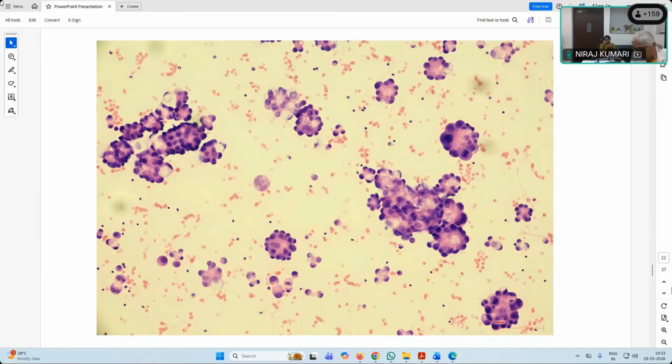What other markers will you think if it is an endometrial cause of ascites, which is not usual? ER, PR, ma'am. And CD10. CD10 is positive in endometrial stromal sarcomas rather than carcinomas. These look epithelial, no? Yeah, these look epithelial. So the easiest thing to do is first a cytochemical stain. If it is not helpful, then you go for immunohistochemical stains, according to your DDs.